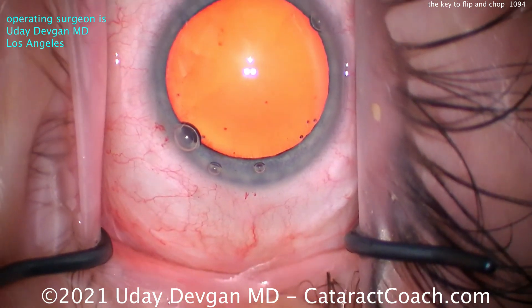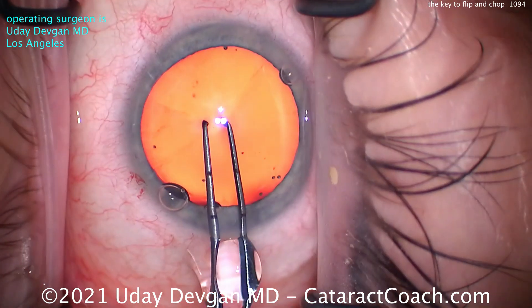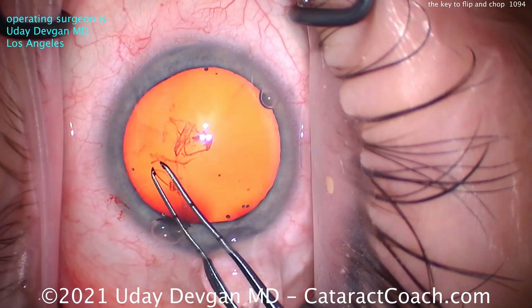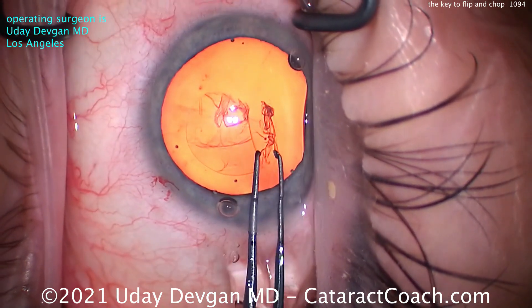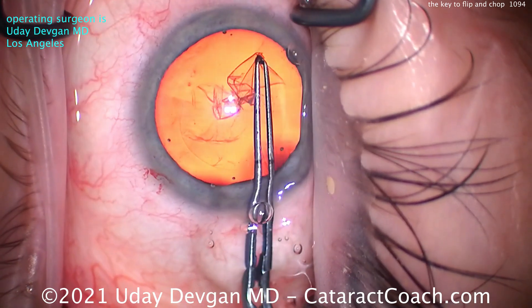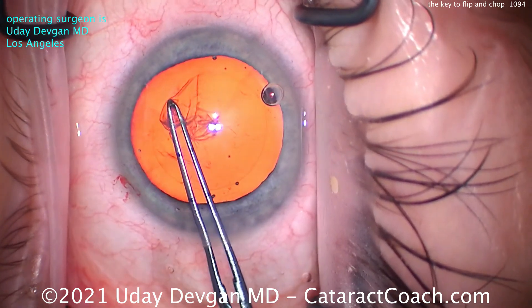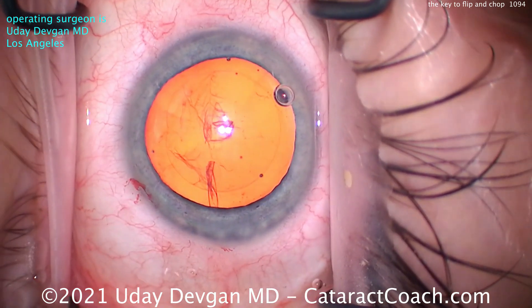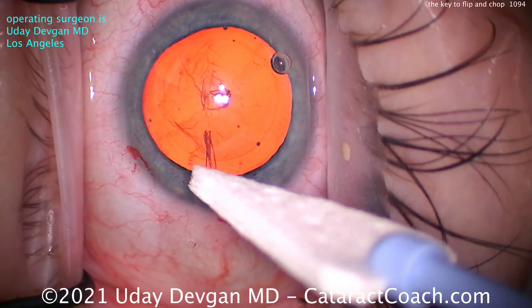Let's see the rhexis and see what we can do here. We're aiming for about a 5.5 millimeter rhexis, measuring it out with the forceps to get a mental idea first. Starting that rhexis, pivoting around, nice and easy. Notice how we pivot in the incision — the forceps don't bang up against the side of the FACO incision; we float in the middle. That's called pivoting in the incision, and it makes for a much easier rhexis.